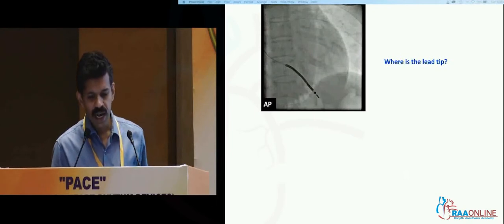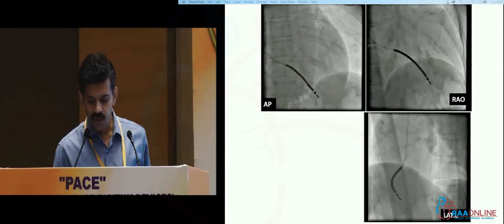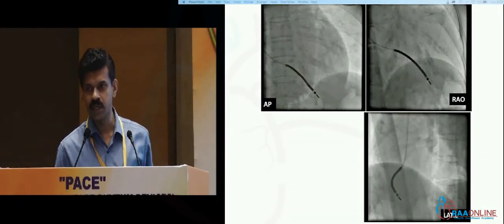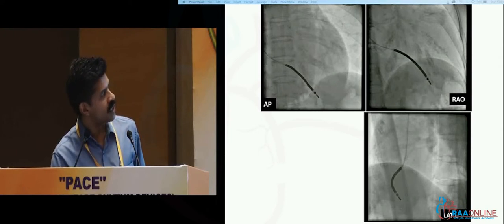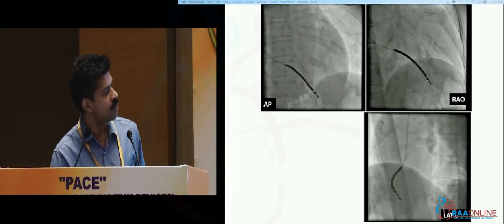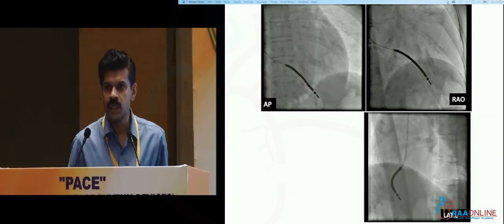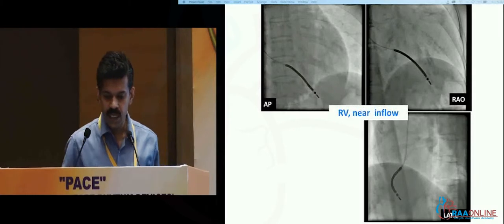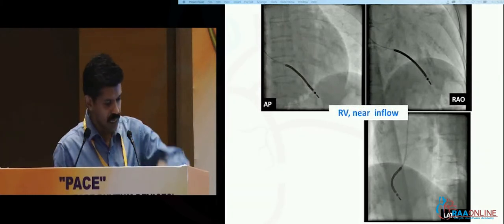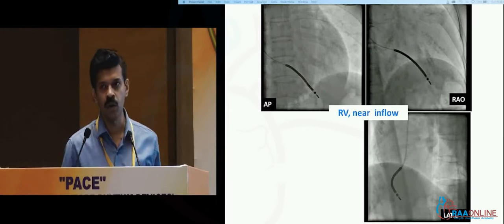Here's another lead. The AP view looks exactly the same as the previous lead, but when you look at the other views it is fairly obvious that this is not at the apex. In the right anterior oblique view it is going down — going caudally — but it is hardly going anterior at all. If you had to go anterior, you would go towards this border. You can see the same thing in lateral: it is going down but not at all going towards the sternum. So this is in the RV, it has just gone straight down somewhere near the inflow of the RV, which is why in the right anterior oblique it is hardly gone forward.